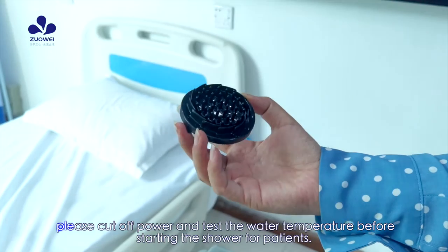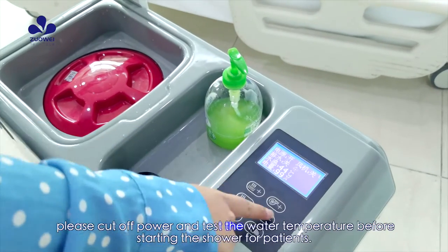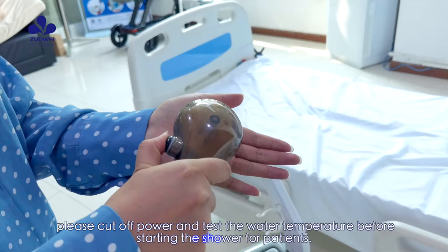After heating finishes, please cut off power and test the water temperature before starting the shower for patients.